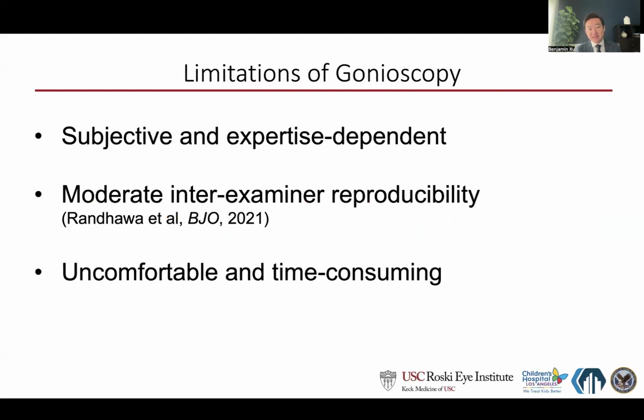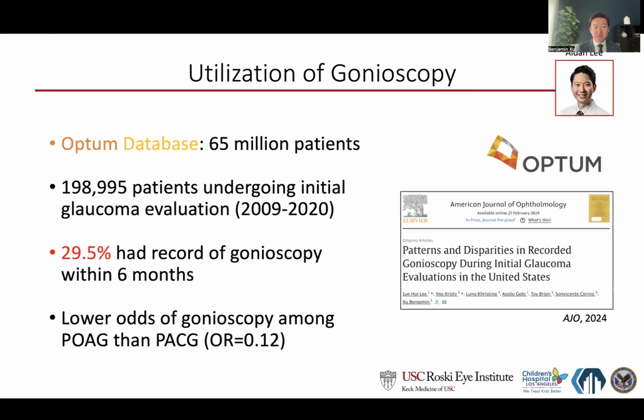Despite being the long-standing clinical standard, gonioscopy has a number of limitations. It is subjective and expertise dependent, and there's only moderate inter-examiner reproducibility even between trained glaucoma specialists. Gonioscopy can also be uncomfortable and time-consuming for some patients.